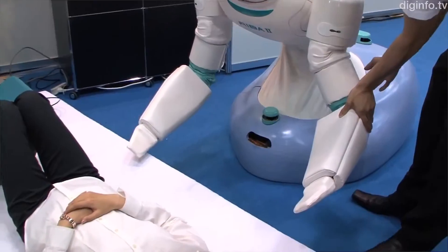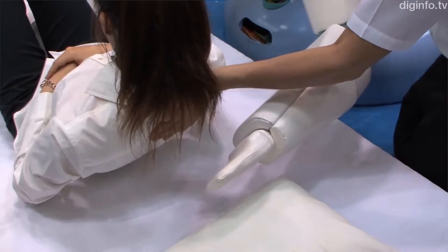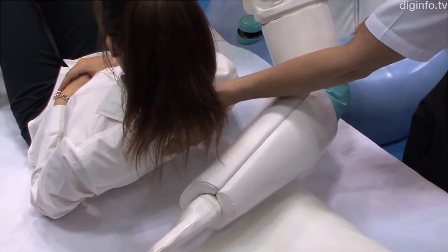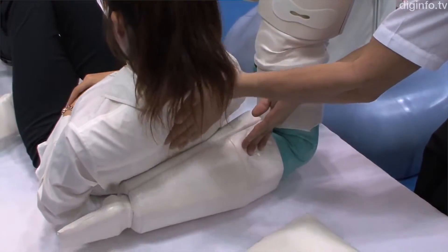In Japan, with the elderly population in need of nursing care projected to reach a staggering 5.69 million by the end of 2015, Japan faced an urgent need for new approaches to assist caregiving personnel.